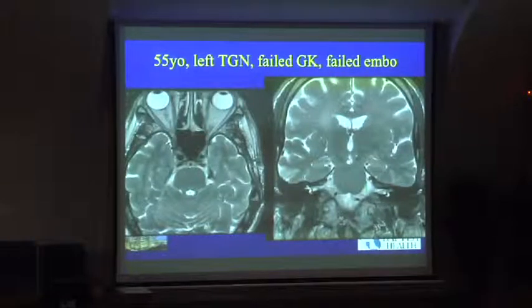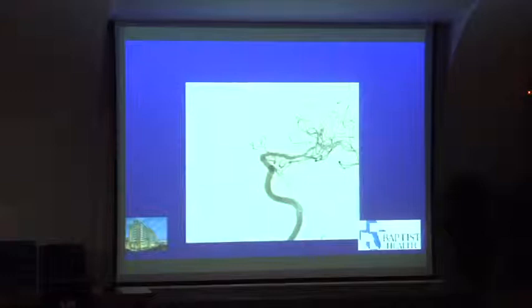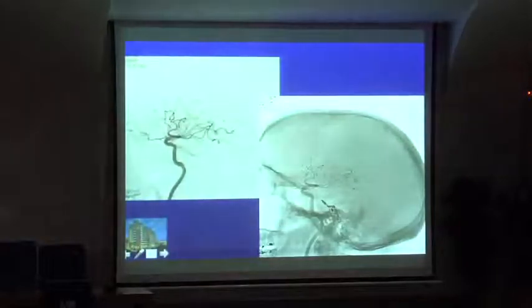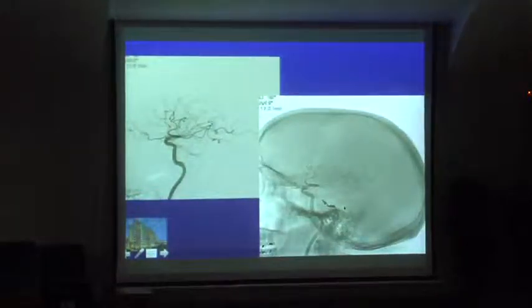He got gamma knife for trigeminal neuralgia, but the neurosurgeon that saw him before the gamma knife failed to recognize that he had a big offending vessel right into the trigeminal nerve. So he went to see an interventional radiologist that decided to do an angiogram to see what was going on, because there was a dilated vessel and it was found to have a dural AV fistula fed by Bernasconi Cassinari that would end up being treated with a transvenous approach with occlusion of the vein.